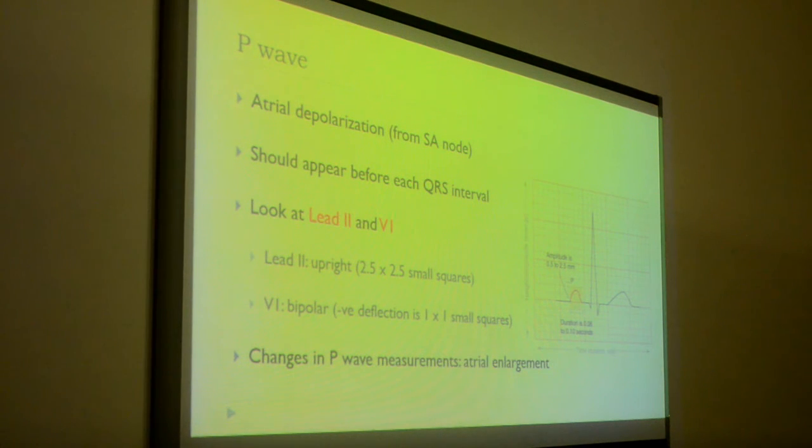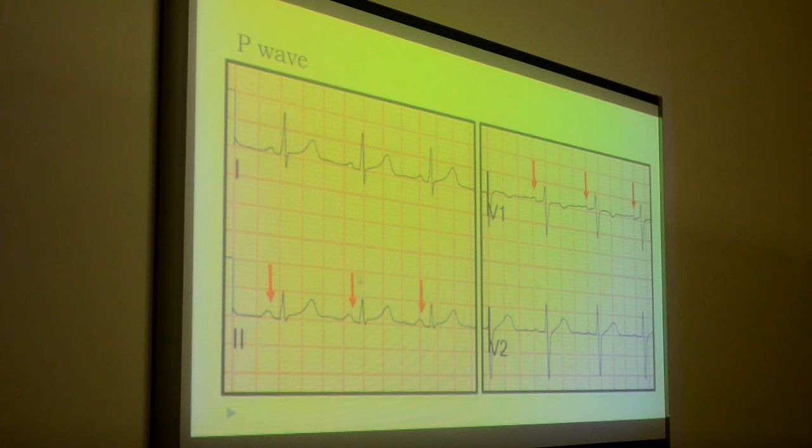Regarding the biphasic P wave, both a positive and a negative deflection are included. Look mainly at the negative deflection. The positive can be variable, but when you want to see the size, you look at the negative deflection only. Yes, the negative is the most important thing.